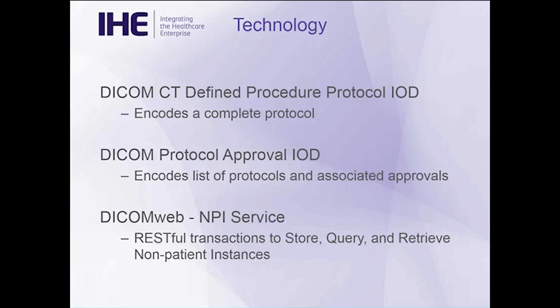Second thing is it says CT. The profile is written with the idea that this can work for any modality. However, currently we only have a DICOM object for the CT protocols. This is relatively new. There is some work underway to look at angiography, and there's been interest expressed around PET and MR, but that work hasn't started yet. So at some point in the future, this profile may be applicable to other modalities. Initially, it's just for CT.